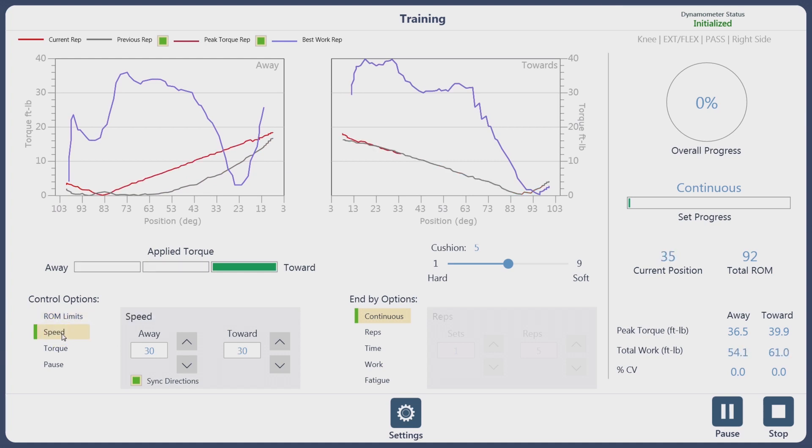You have your range of motion limits, your speed both away and toward, your torque limits, and your pause. This is similar to the previous biofeedback screen on the previous software, or the panel control or knob control.